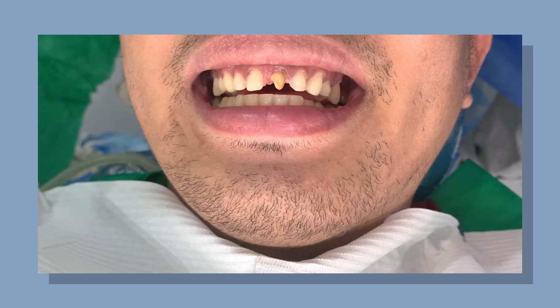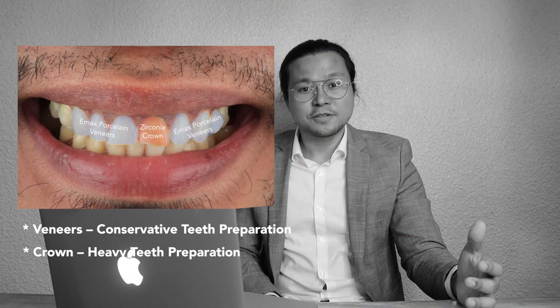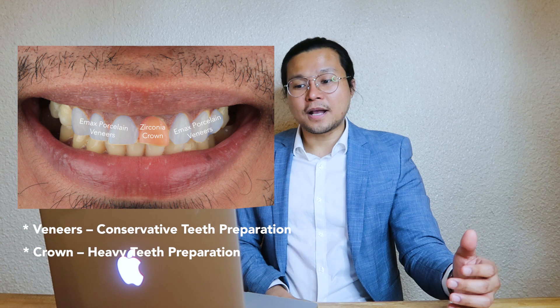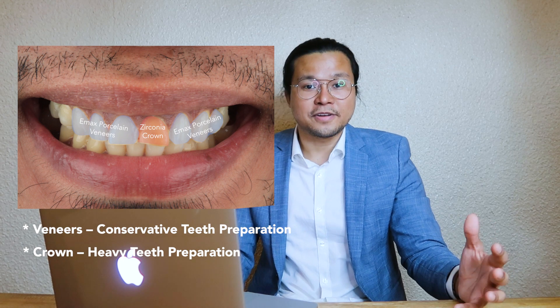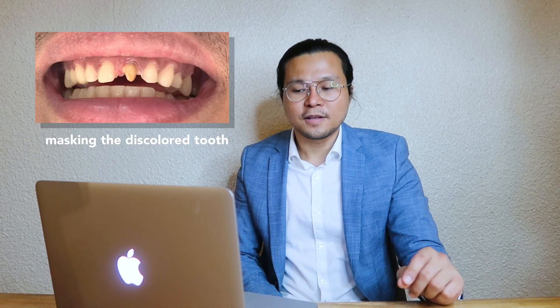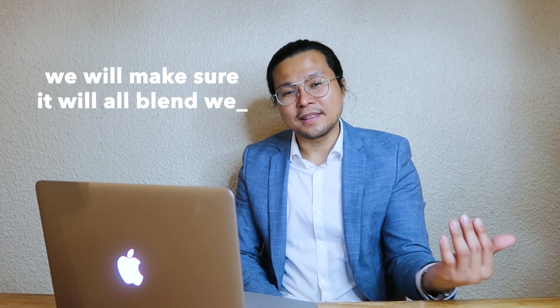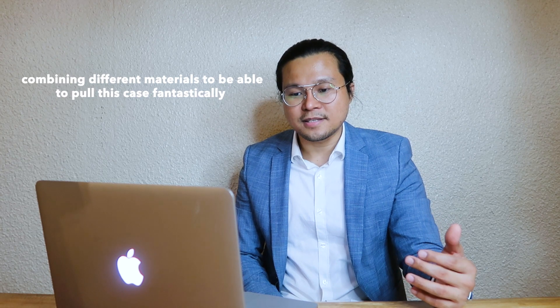For the teeth preparation, I always want to go minimally invasive. That's why the 7 teeth are indicated for veneers — the material used is Emax, since it's for veneers only, which is conservative. For the crown, it's a heavier prep because we have to mask the discolored tooth to ensure everything blends well. Especially on the front teeth, it's very, very tricky if we are not using or combining different materials, just to be able to pull this case off. We have to make sure it looks natural.